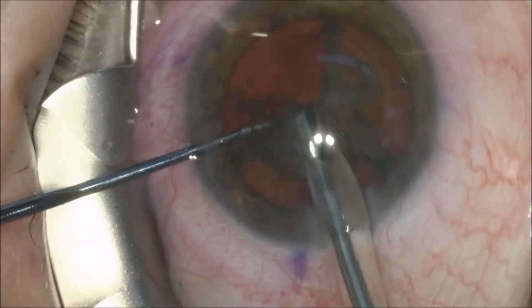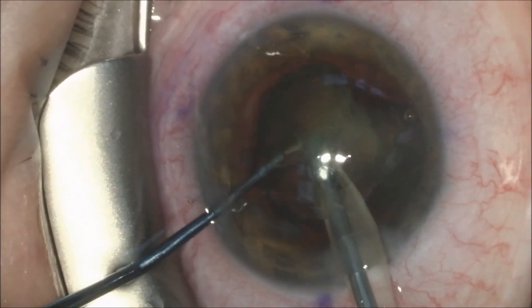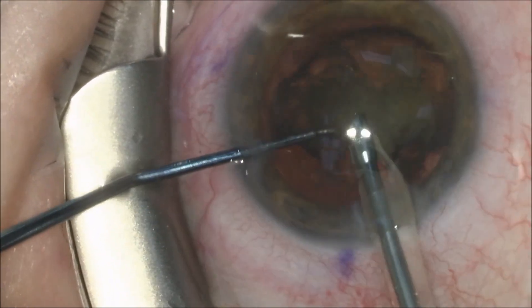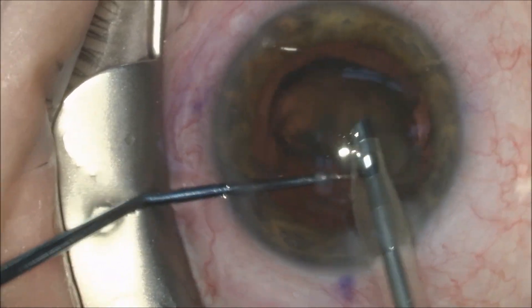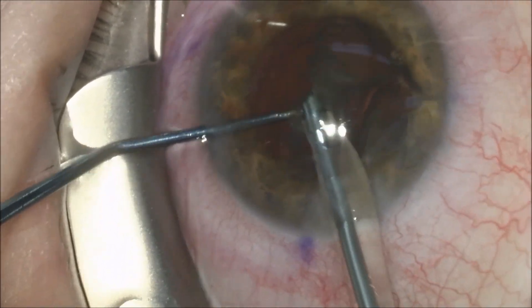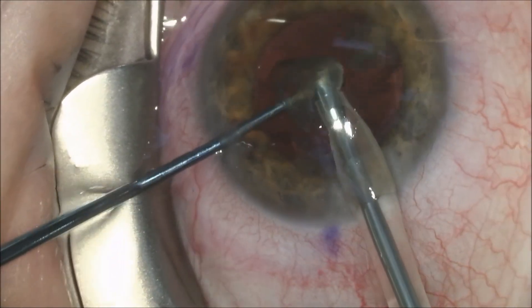it is emulsified by the phacoemulsification machine and the pieces are aspirated into the phaco handpiece. The steel portion of the handpiece is actually a phacoemulsification needle that vibrates at 20,000 to 40,000 times a second depending on the machine being used, and it breaks the cataract up into many small pieces that are aspirated through that same needle.